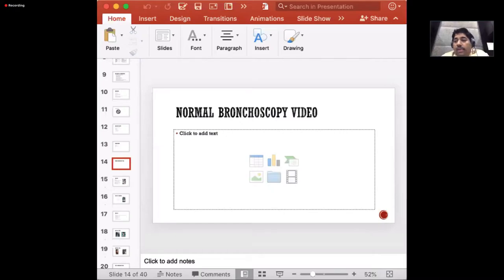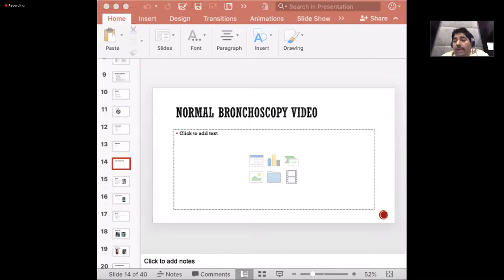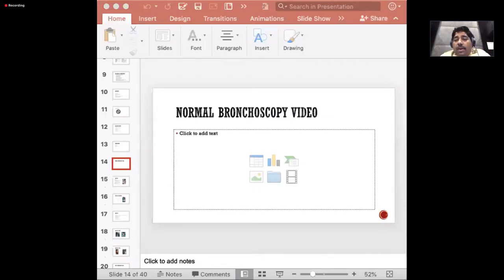Before understanding what exactly is happening, we should know the normal anatomical structures. I will show a quick video of a normal bronchoscopy.